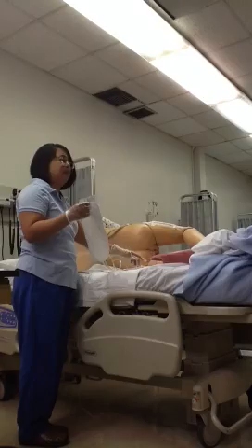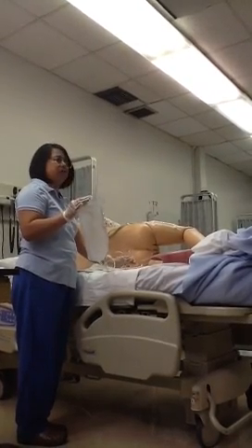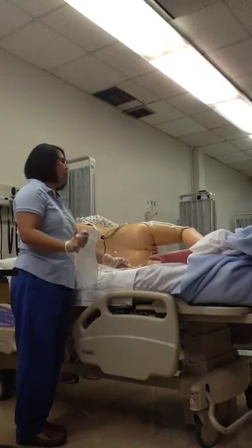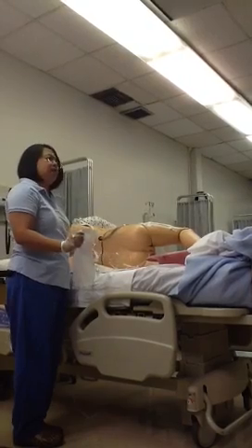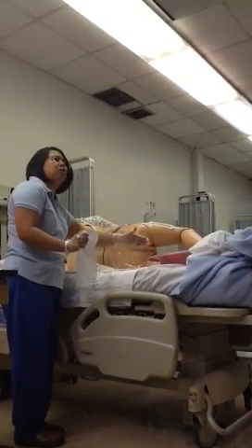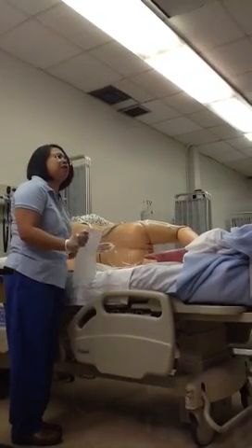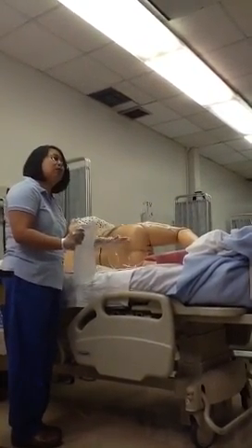If he's cramping, then clamp it. Give him time to recover a little bit. Lower the bag even a little bit more, and then unclamp it. All right? The lower this bag is, the slower the flow goes into him. Does that make sense? Because sometimes that cramping, it's because you're infusing it in him too fast. So if you start slow, you'll be okay.